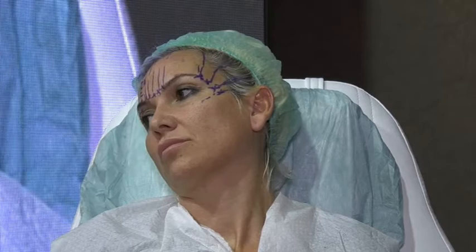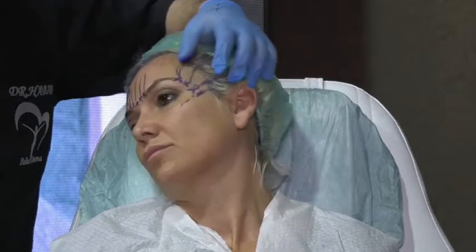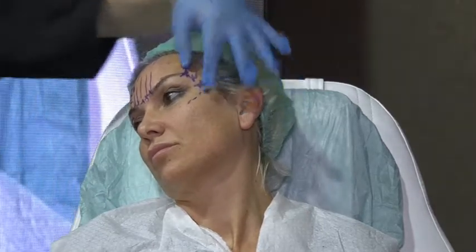Tamam? Okay? Look, what this can do for you. So that's the way, as I told you, the first 3 you can easily do, 16, 19, no problem. The only one you have to be very careful with when you do it is the last one, because it's really painful and tight for you. So now we finish the first zone. Anybody has any comment about this zone? Any question about this zone?